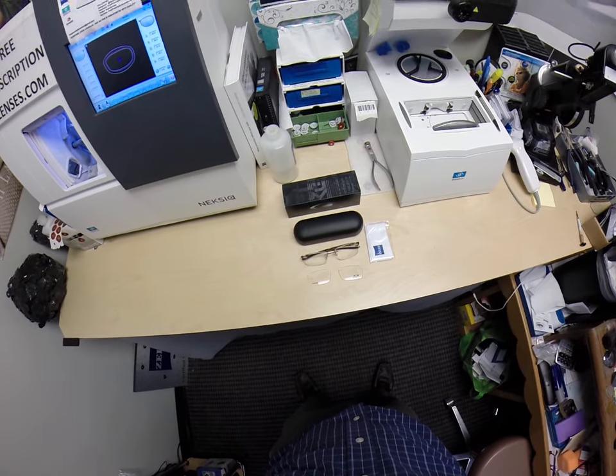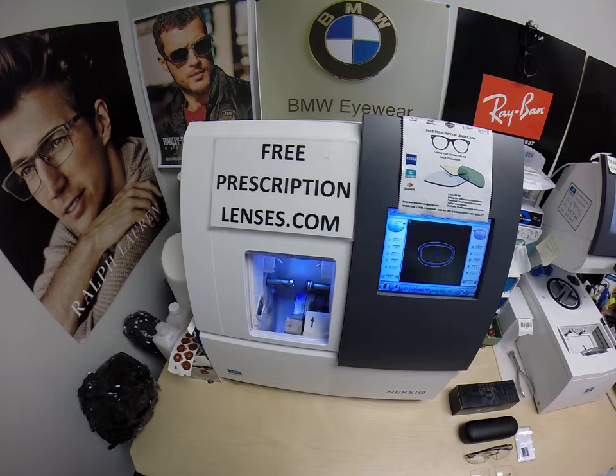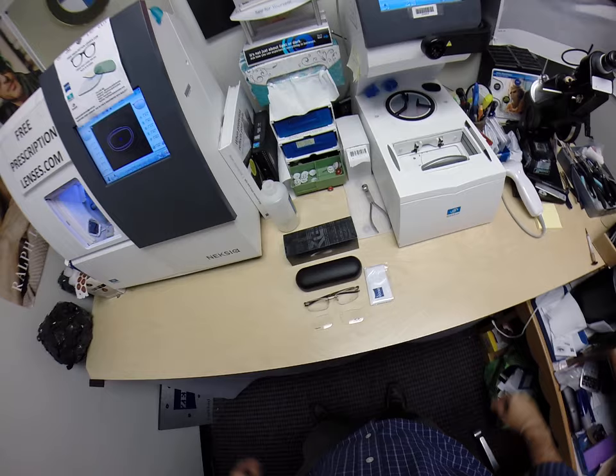Hello everyone, and a special thank you to George in Greenwood, South Carolina. This is freeprescriptionlenses.com. I am Seymour Better, the hardest working man in the optical industry. I want to take a moment and show you the Gauge 3.1.